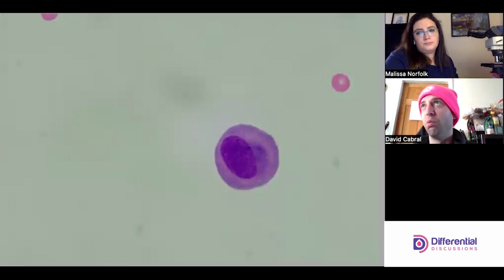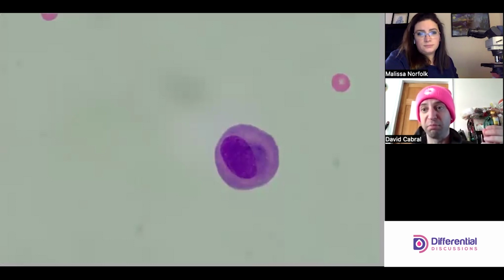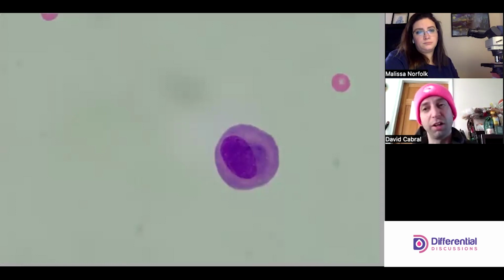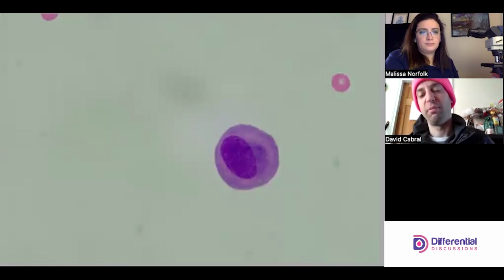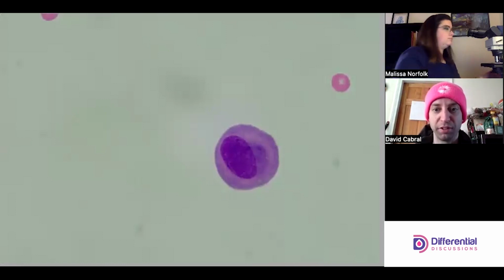We should probably reflect on the clinical significance of making these two different calls, right? So how does the clinical team react to it? I would say generally it's of little consequence to the patient. We want to be right. I think all of us like being correct about the call, but yeah, it's just challenging. But this looks more like a meso, right? Pretty reasonably healthy one.